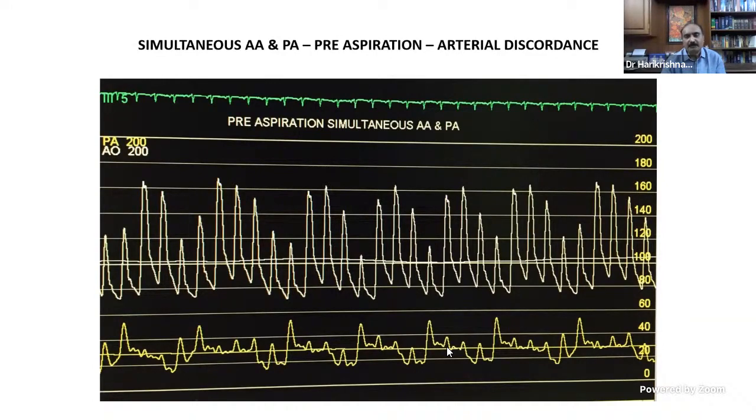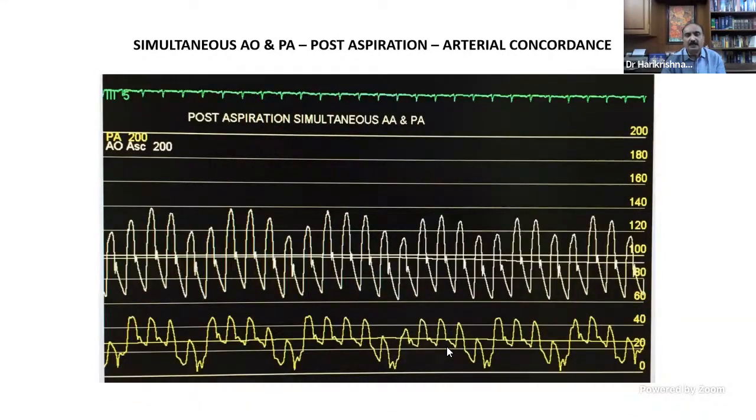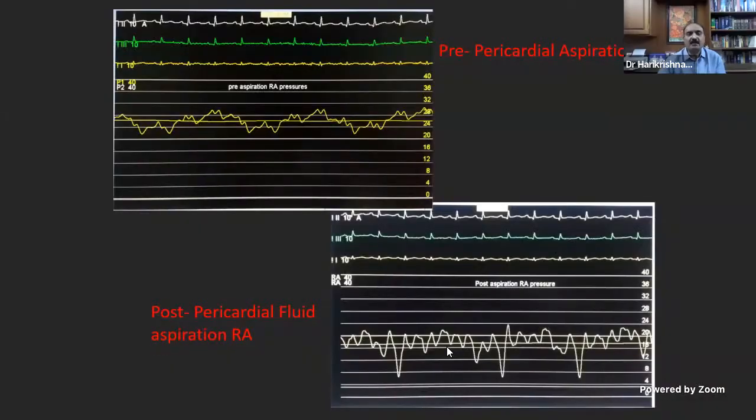So this post-aspiration, what has happened? The discordance has disappeared. Now there is concordance. They're moving in phase. Yes, moving in phase. Once you have aspirated, it came back to concordance. Okay, now we will go to a different set of traces.